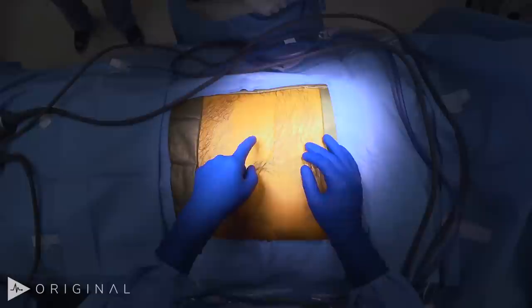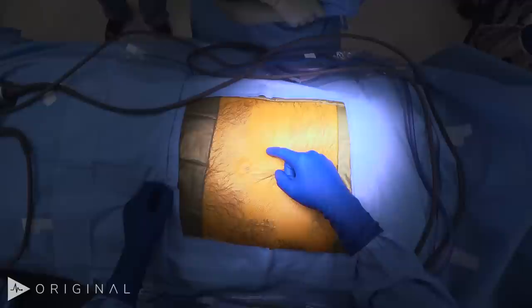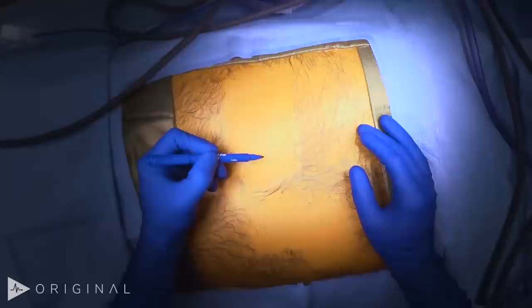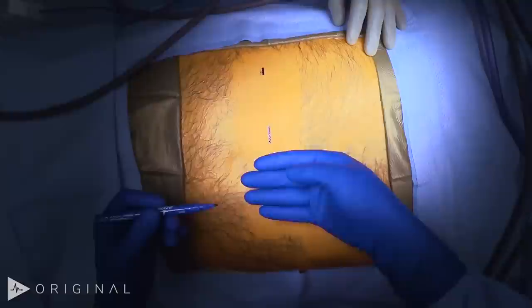I've got a spot here for Palmer's point. Robotic TAPP uses three ports just above the umbilicus, pulled back from the umbilicus. This patient has a right-sided hernia, so we're going to put a 12mm port here, with two 8mm ports on either side — all three ports in a line. I generally never put a laparoscopic port through the midline; all ports need to go through muscles to avoid hernias. I space the ports about four finger-breadths apart.